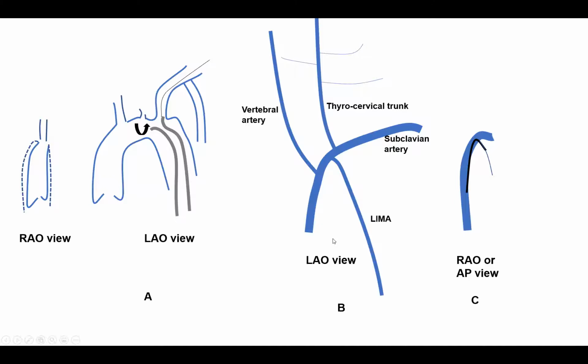Again, the same ideas here. So one, you have to decide which catheter, two, which view, and three, which maneuverings. So catheter, we agree, IM is usually the best catheter because IM in this position is a catheter that points most down and can embrace the ostium of that IMA. You can try JR4, but it's usually not the best. There is another catheter that points even more down than IM. It's called BC catheter, and you can try that as well. So we agreed, we got the IM catheter.